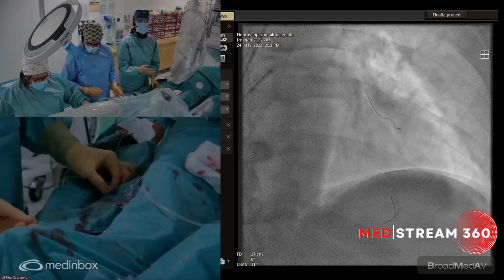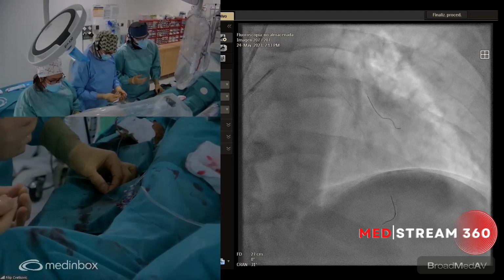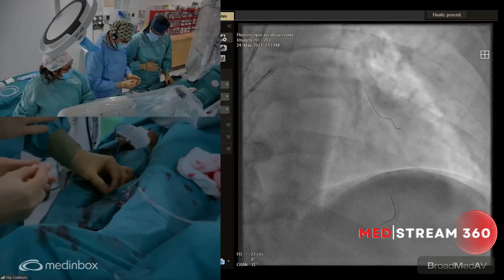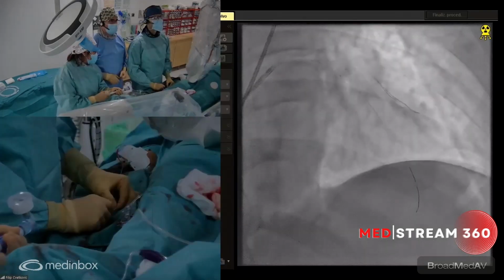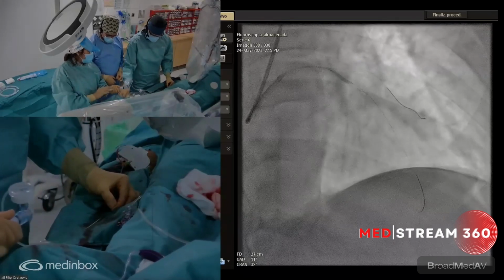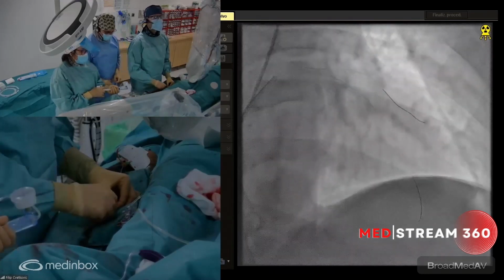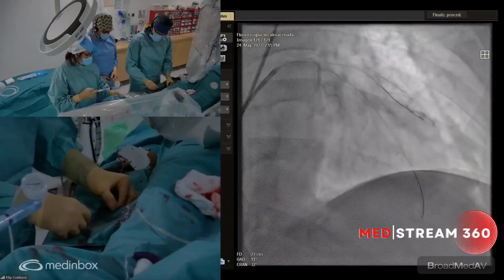It is similar to the C2, but we have 120 pulses. And also another good thing is that the balloon has a plastic cover inside the box. Okay, enough. 2 atmospheres. Okay, the balloon can cross easily. Test, please. Okay, let's go with the shockwave balloon.